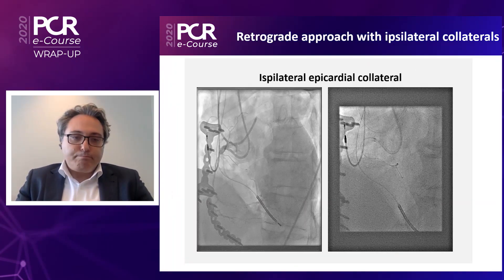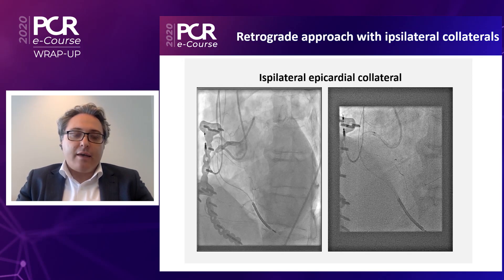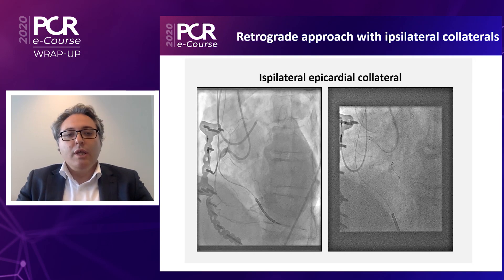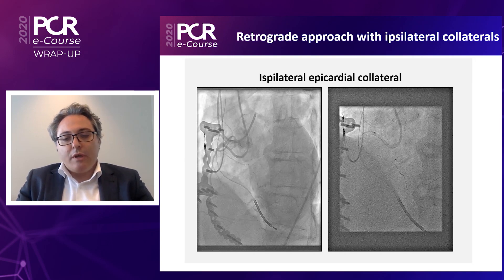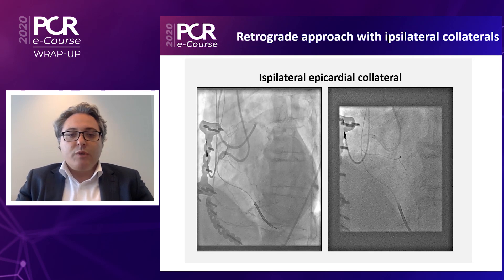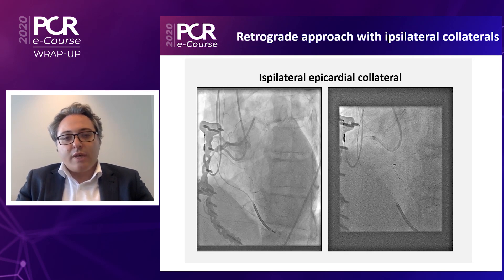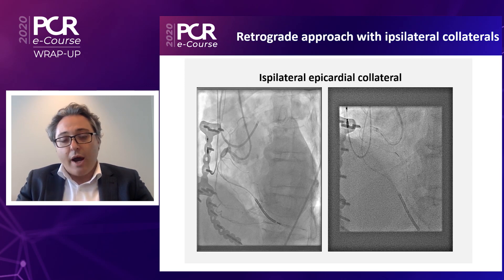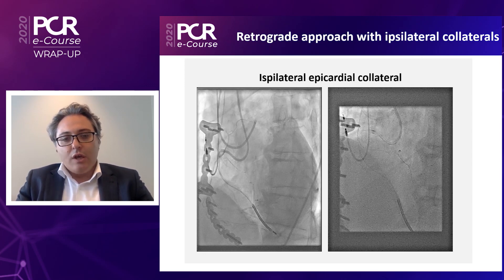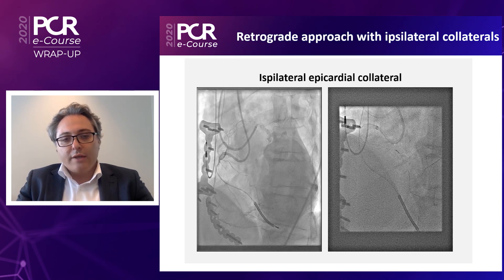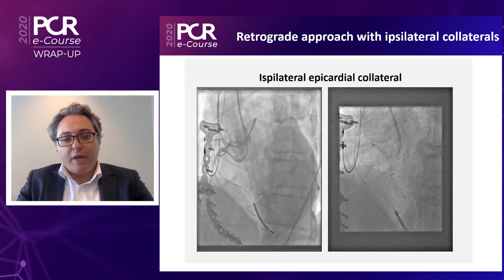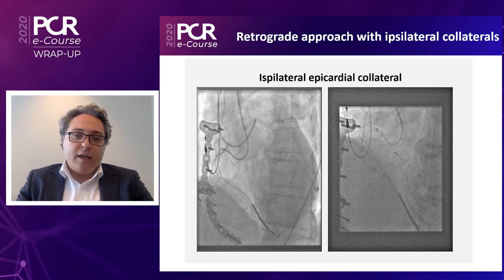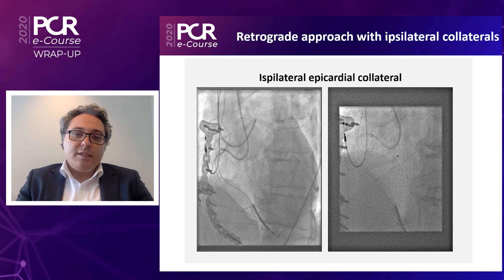As you can see here, there is an epicardial vessel — very tortuous and small — coming from the proximal right to the distal right. We tried to navigate it, and we succeeded with a dedicated wire for epicardial use, the Suoh 03, and a Caravan microcatheter. We were able to navigate this micro channel and reach the distal right coronary artery.